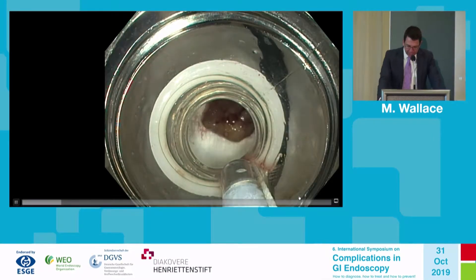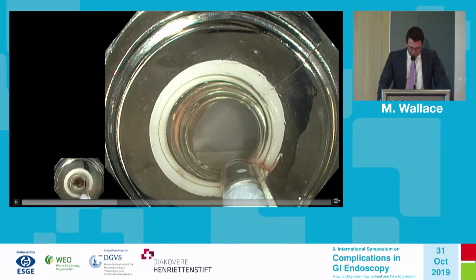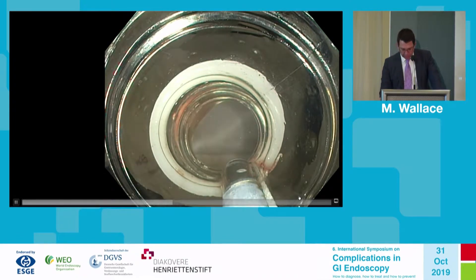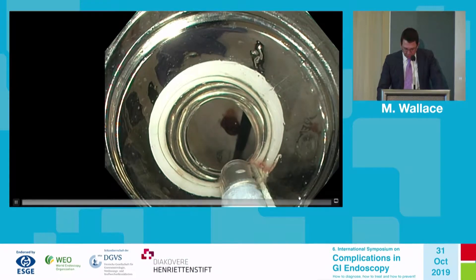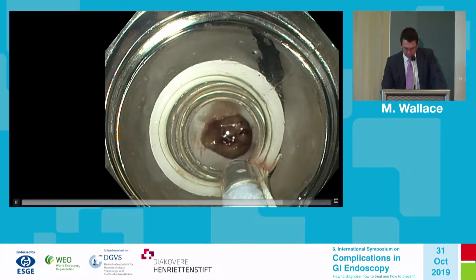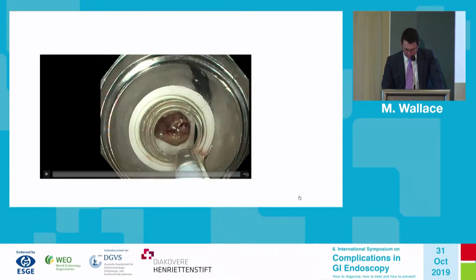Here's the lesion on the bedside — approximately a 1.5 to 2 cm lesion. You might be able to appreciate that all of the electrocautery marks were visible surrounding the visible nodular lesion.